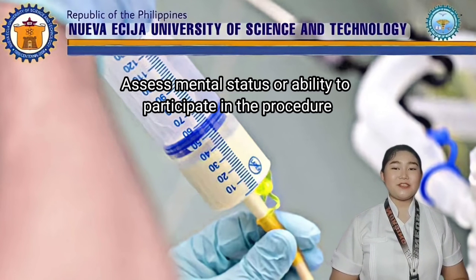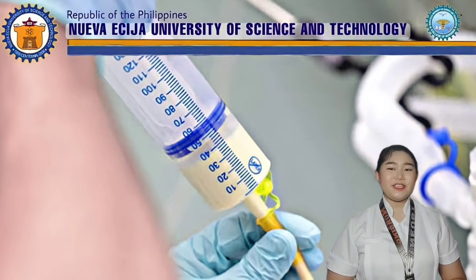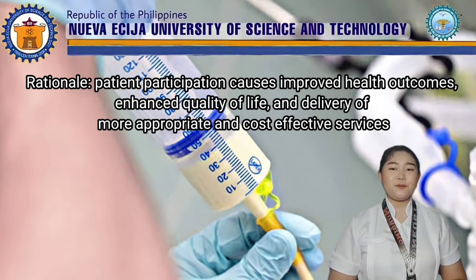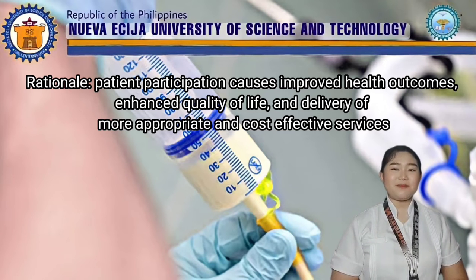Assess mental status or ability to participate in the procedure. Rationale: given the patient's participation causes improved health outcomes, enhanced quality of life, and delivery of more appropriate and cost-effective services.